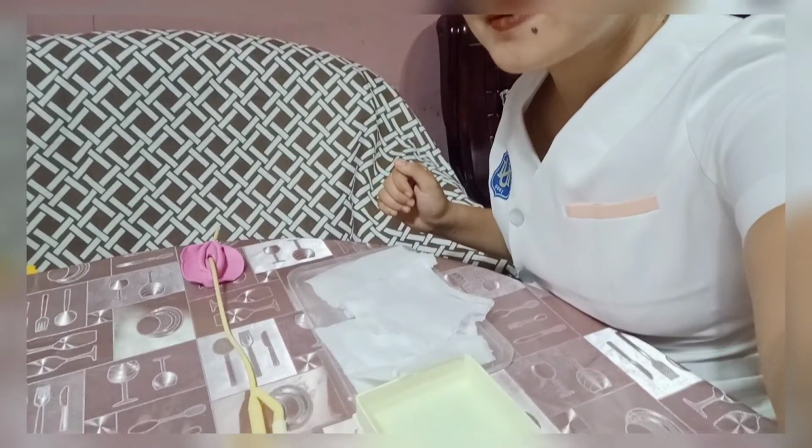Prior to performing the procedure, we have to expose the area where we could perform the procedure. Let's begin the procedure by washing our hands, wearing clean gloves, and providing some privacy to our patient.